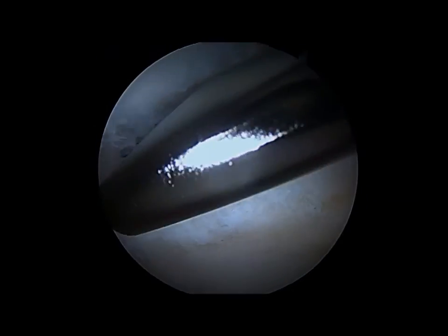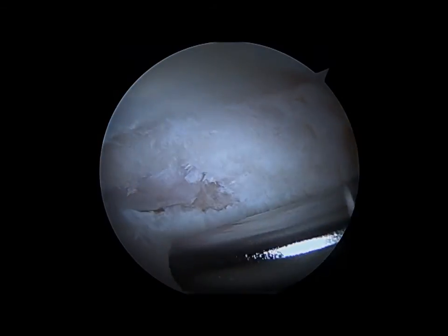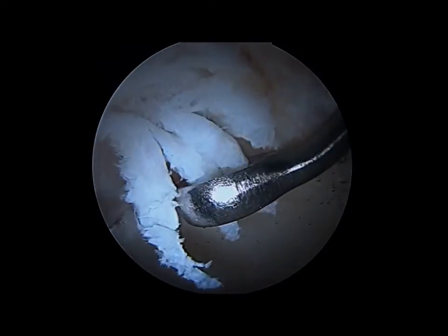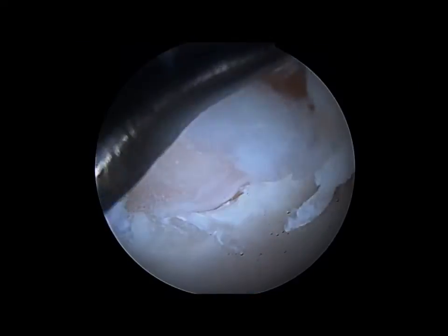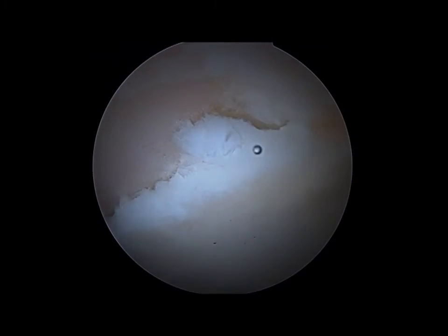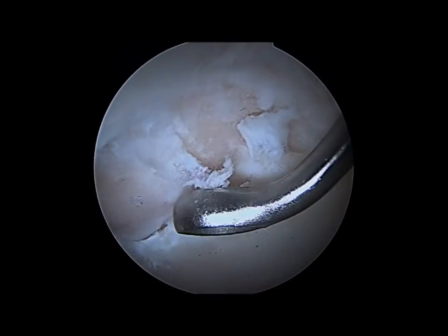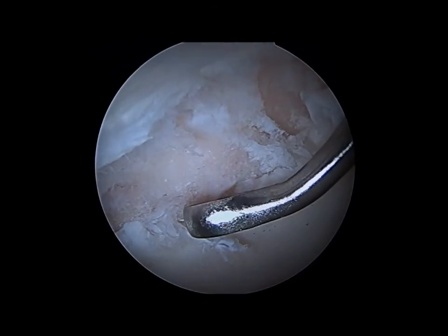After the chondral lesion is identified, unstable flaps of cartilage are debrided with a shaver. Next, the rim of the cartilaginous defect is carefully cleaned with arthroscopic curettes to create stable cartilage shoulders that are perpendicular to the subchondral surface. These vertical walls help contain the marrow clot and create a load-bearing transition zone. Next, the calcified cartilage layer is removed with curettes. Removal of this calcified layer affords better clot adhesion. Care is taken not to disrupt the underlying subchondral plate.